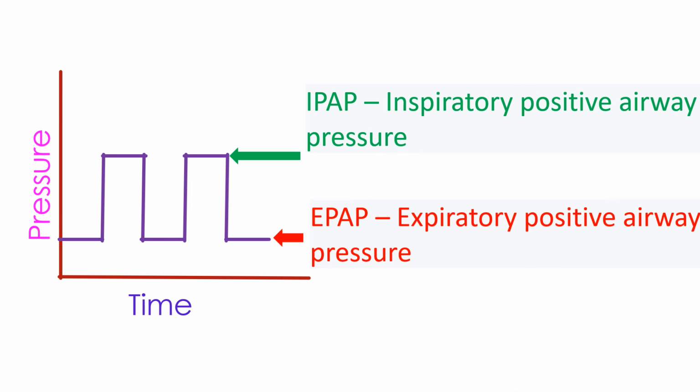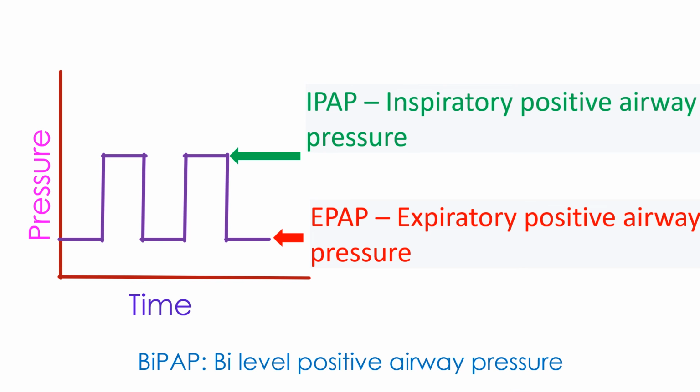The non-invasive ventilator usually supplies two levels of pressure, one during inspiration and another during expiration. Pressure applied during inspiration is higher than that in expiration. A simpler type uses continuous positive airway pressure and is known in short as CPAP, mostly used for obstructive sleep apnea. Non-invasive ventilation with different pressures in inspiration and expiration is known as bilevel positive airway pressure or BiPAP ventilation.